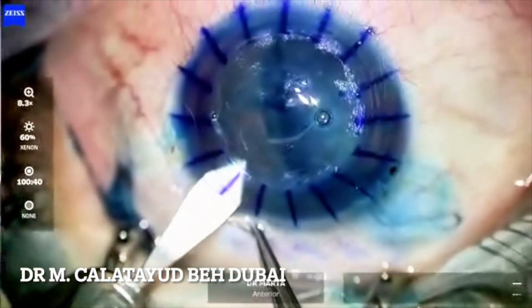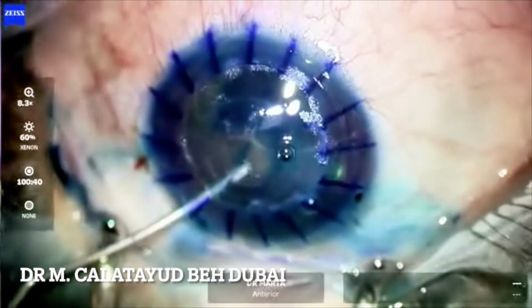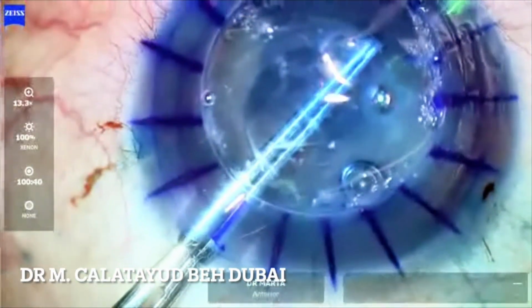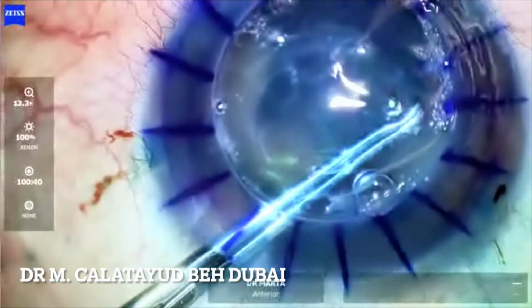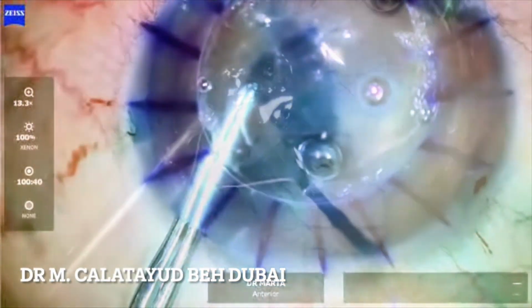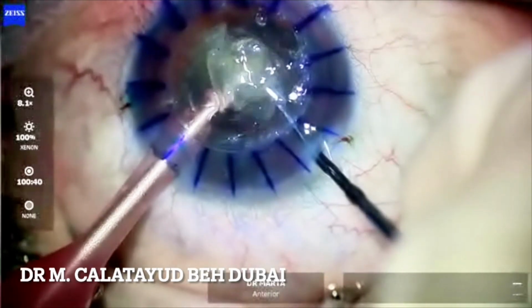If we don't get a proper capsular rhexis, it will be very difficult to avoid tears in anterior or posterior capsule and lens dislocation, due to the pressure changes during phacoemulsification. Once we performed phaco, we proceed to remove the cortex and we implant a monofocal lens.